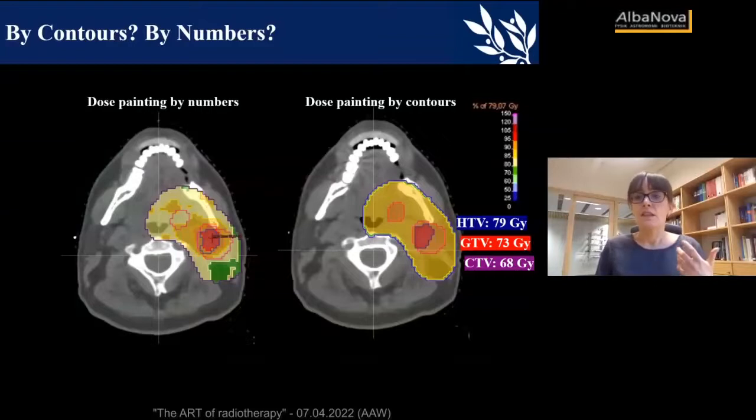And indeed, in the literature, we find that different groups have proposed different strategies. One goes under the name of dose painting by number, which corresponds to the use of a small brush for painting the dose, so painting the dose voxel by voxel, according to what has been previously calculated by, for example, radiobiological modeling. Or we could actually start from this heterogeneous dose distribution in the patient and then use it to calculate some uniform dose escalation levels within the tumor.